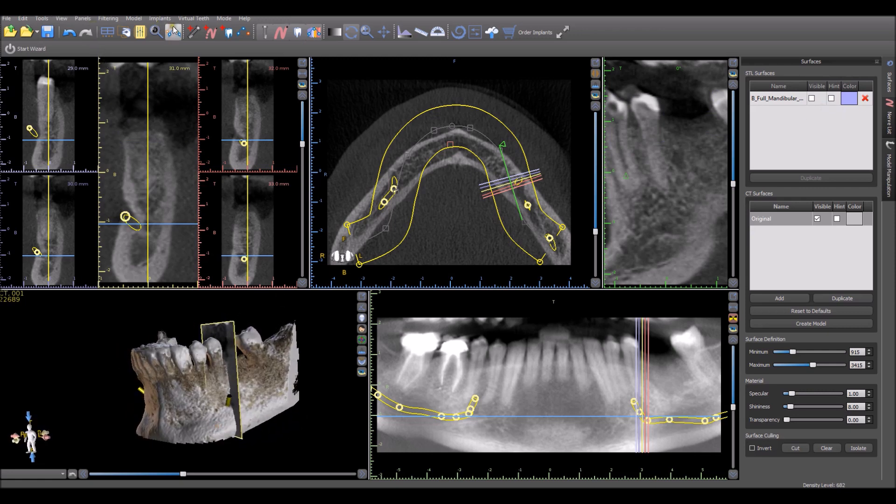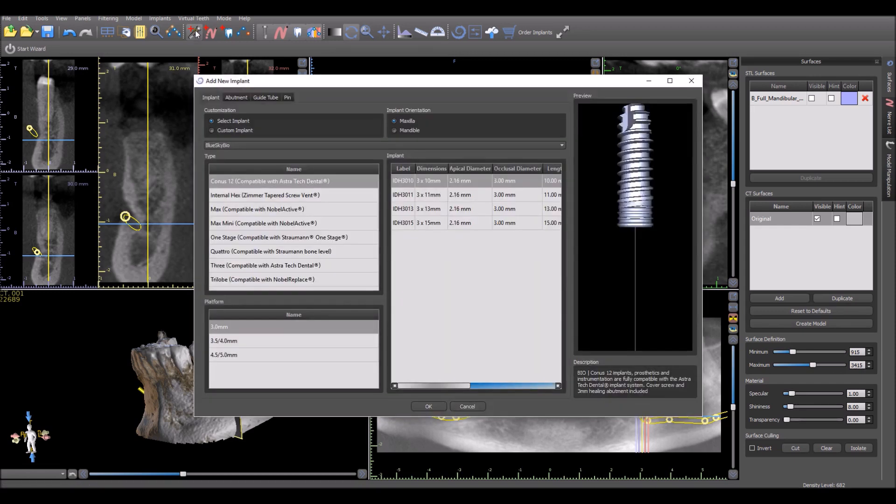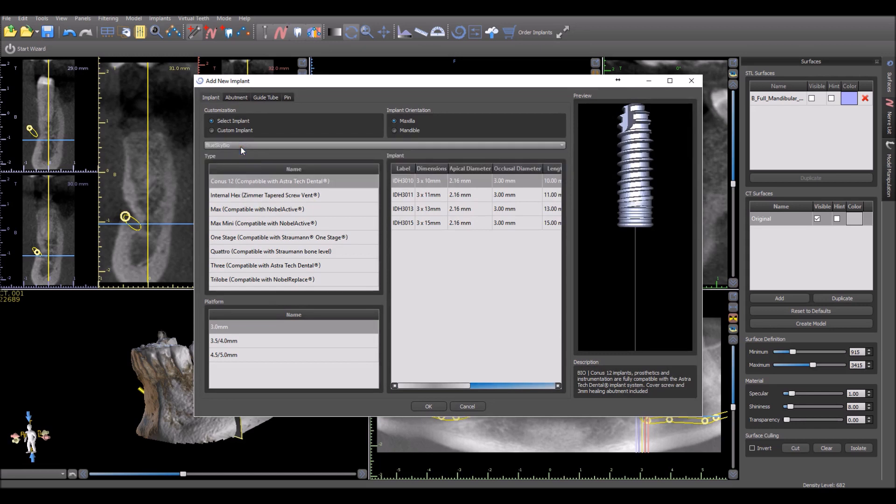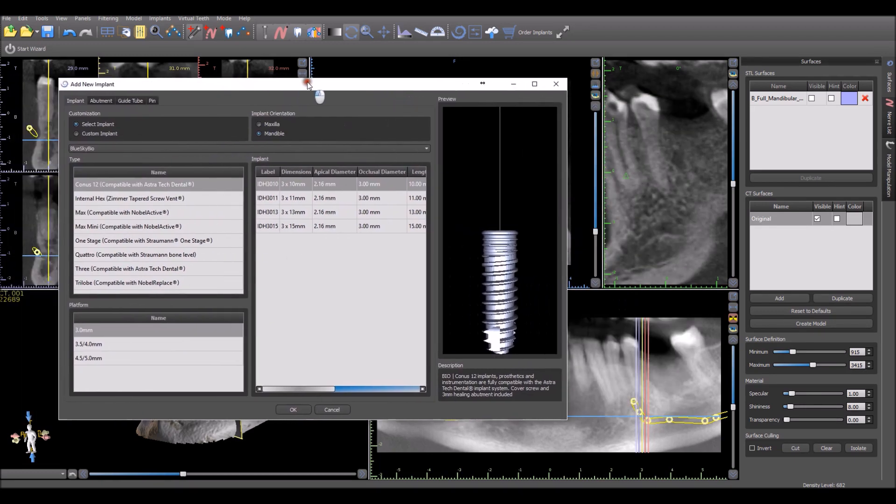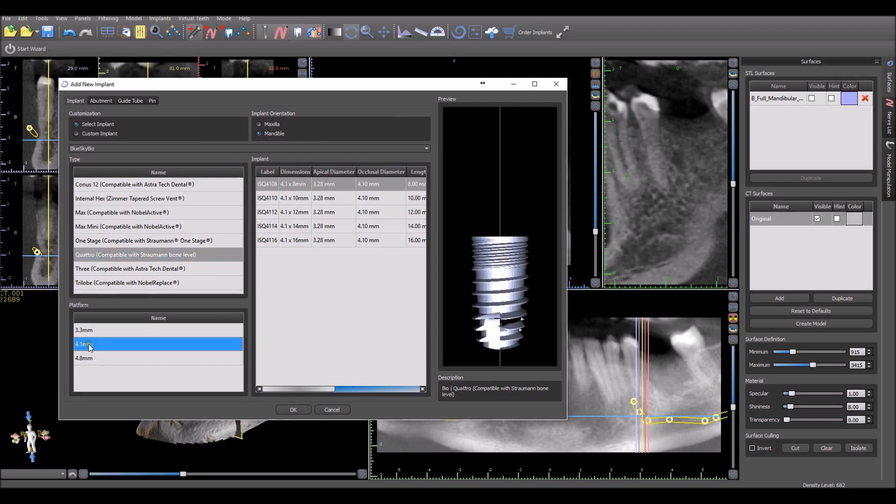We go ahead and select Add Implants. Here we have the Blue Sky Bio implant library, compatible with Straumann, Zimmer, Nobel, and Astra. We also have some other additional systems listed here as well. You want to select the correct jaw type, the relevant implant that you want to place.